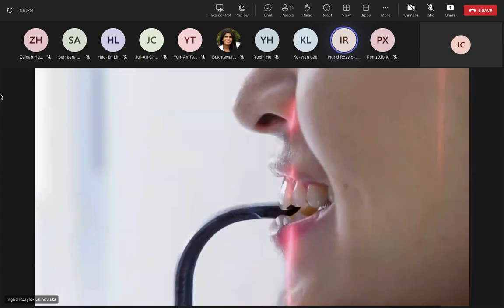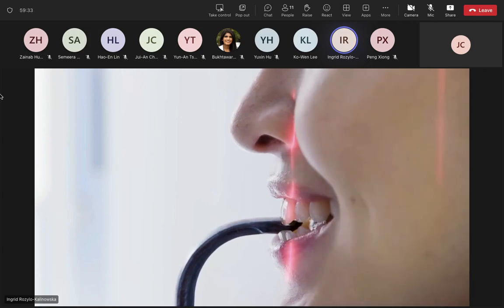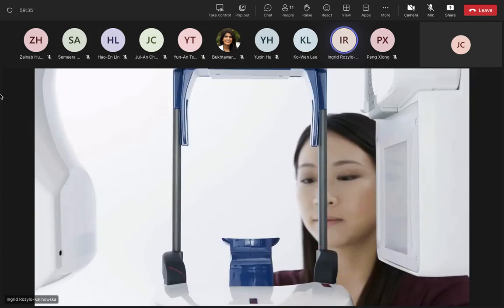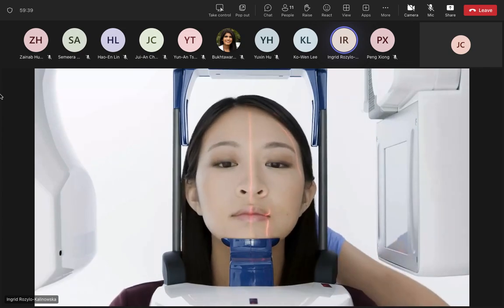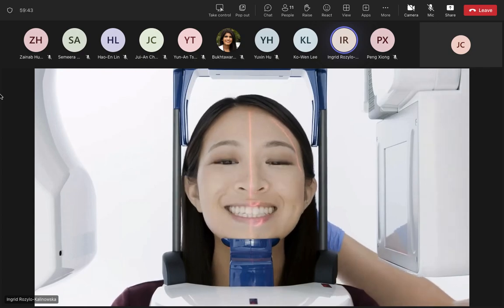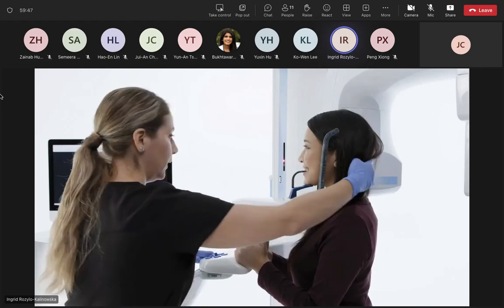Instruct the patient to bite on the bite stick and visually verify the upper and lower anterior teeth are in the grooves. Patient may also be positioned using the chin cup. The chin cup will keep the patient in occlusion. Use cotton rolls to open occlusion if needed. Lower the bite stick so the patient's chin is resting on the chin rest.